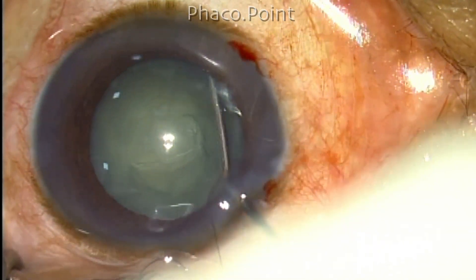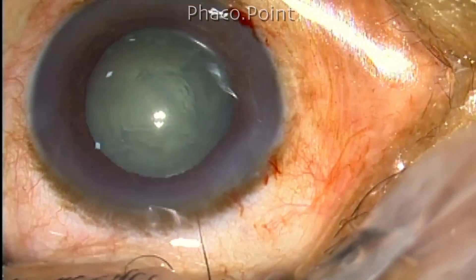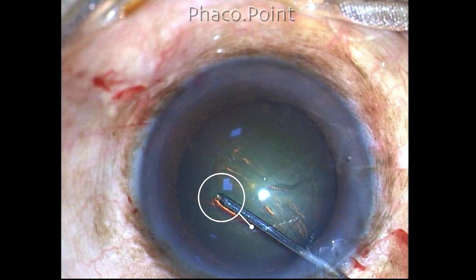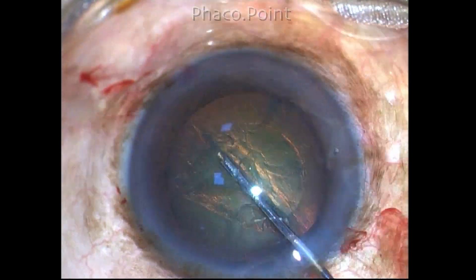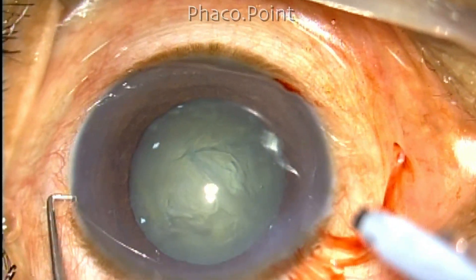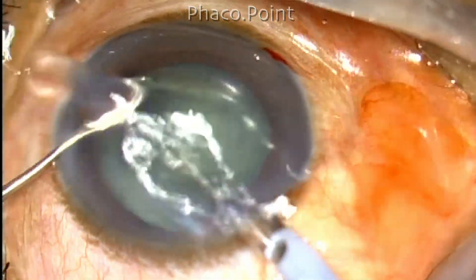In this case, the rise of the central nucleus is clearly visible and the nucleus is rocking as well, which is why I thought the nucleus would rotate. What I prefer is a beveled cannula where the fluid flow comes from a slightly upward direction, and therefore more often than not you will find the right plane for cortical cleavage hydrodissection. This is a single important step I would like you to incorporate in your hydrodissection procedure.